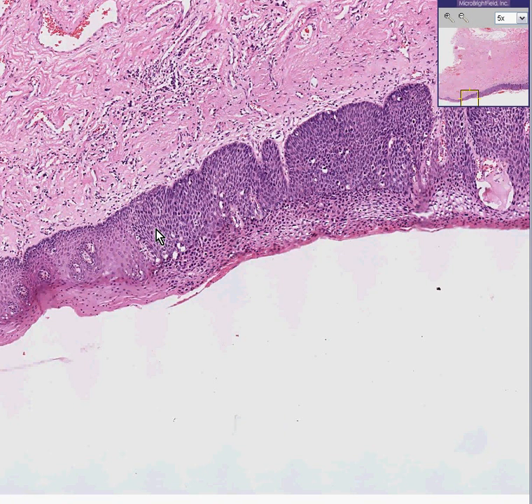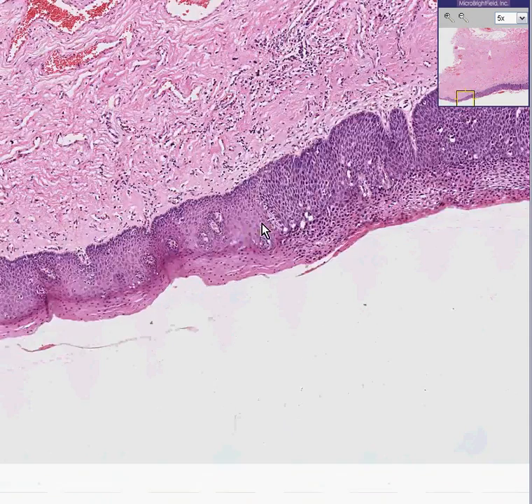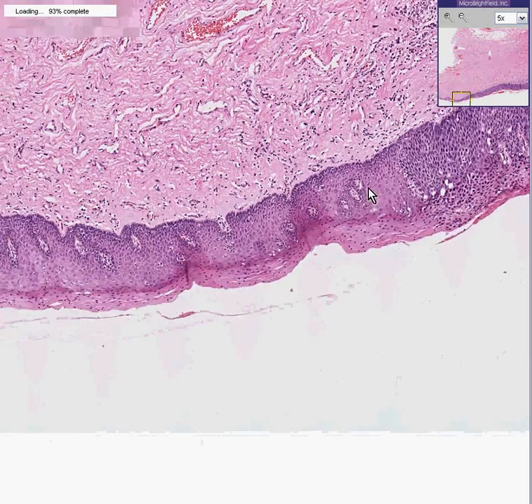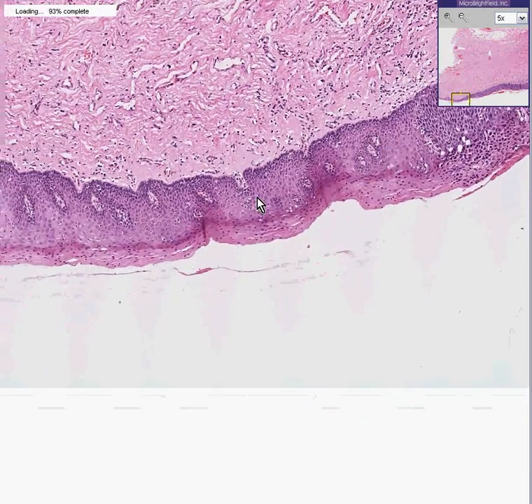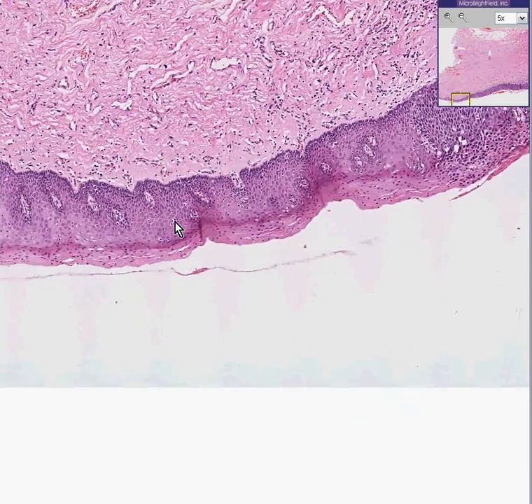One is the mildest; three is the worst. Usually the higher ones — the worst ones, like number three — would be for all practical purposes synonymous with the term carcinoma in situ.